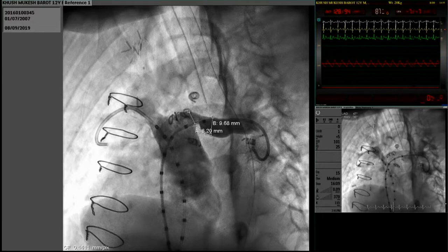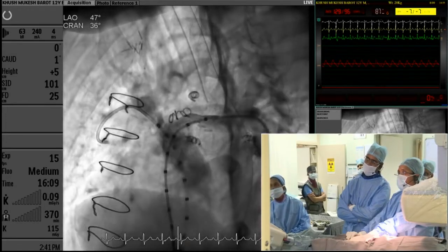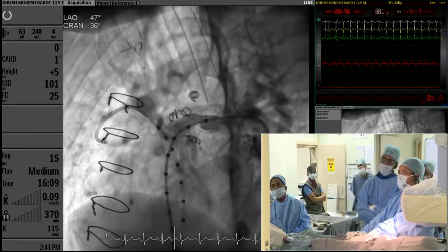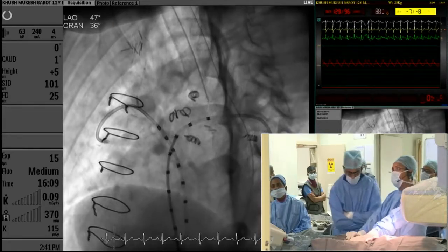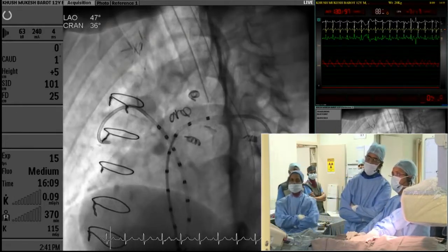So my choice would be a 10 millimeter stent. But as far as the length is concerned, what are the lengths available to you? Because to the best of my knowledge, you have either 30 or 40. Do you have anything in between? Okay. So you are talking about a pre-mounted Cook formula stent. That is one of the choices, I would definitely think.